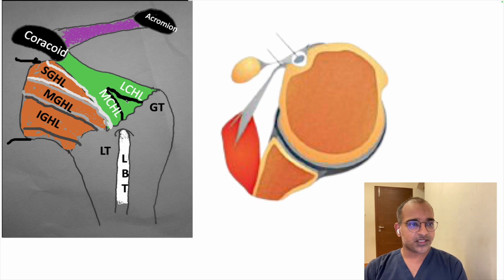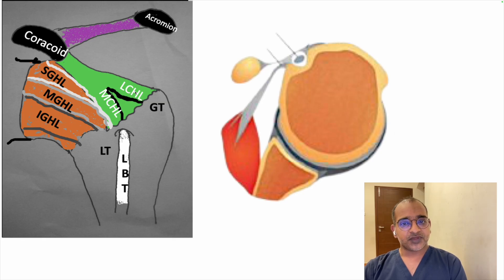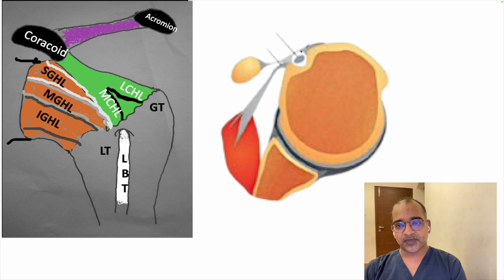Here we can see the rotator interval. In the rotator interval, if you see the ligaments — this is the greater tuberosity, this is the lesser tuberosity. Towards the lesser tuberosity side, we have the medial band of coracohumeral ligament joining the superior glenohumeral ligament. Laterally, this is the lateral band of coracohumeral ligament. In between, the long head of biceps tendon is passing. In the cross-section, this is the long head of biceps tendon, this is the transverse humeral ligament, and this is the lateral band of coracohumeral ligament with the medial band and superior glenohumeral ligament complex.